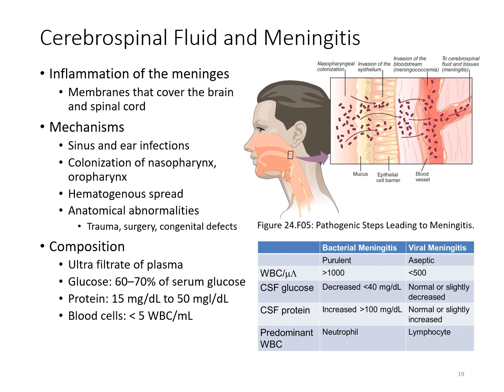It could be introduced through trauma, surgery, or any sort of congenital defects that allow that bacteria to enter into the spinal column. So the CSF fluid itself is basically an ultrafiltrate of the plasma. When we are assessing spinal fluid, it can go through hematology, chemistry, as well as micro. So when you get those tubes submitted, you need to make sure that the correct tube was drawn in the correct order and submitted to the correct department.